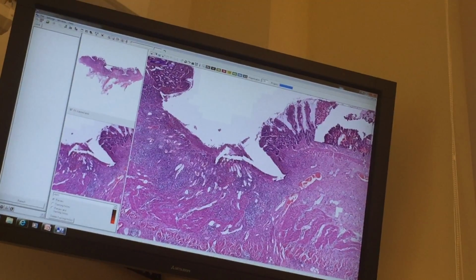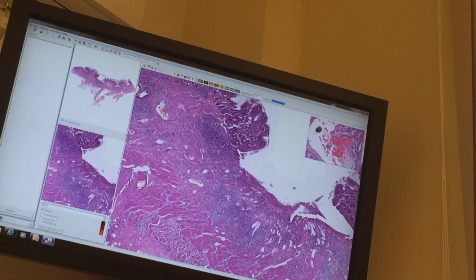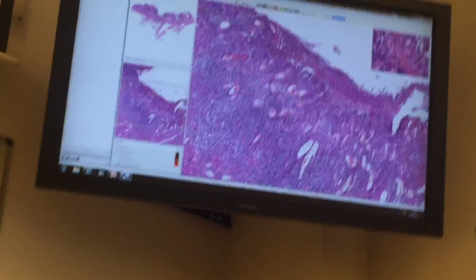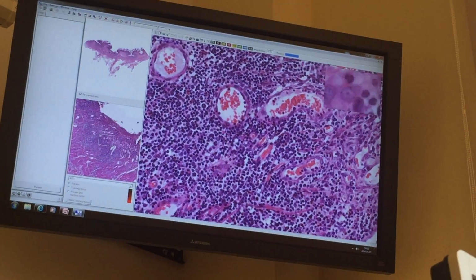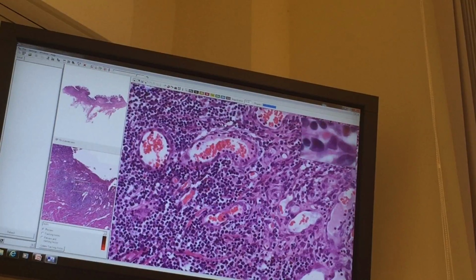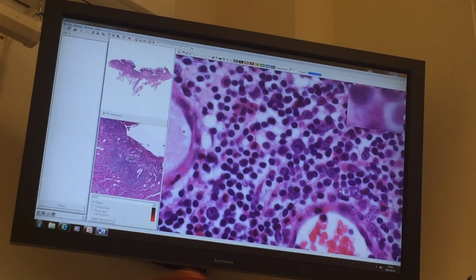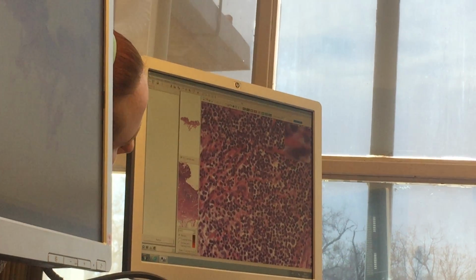What are the pink glands? Where? In the lymphocytes between? Here? No, not this. Lower. Just look at the picture. You can see the lines. Pink lines. For example, this one? Yes, it's more capillaries. No, I mean this one. It's the wall of the capillaries.